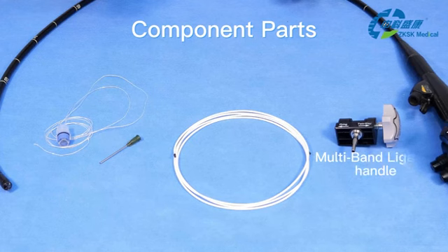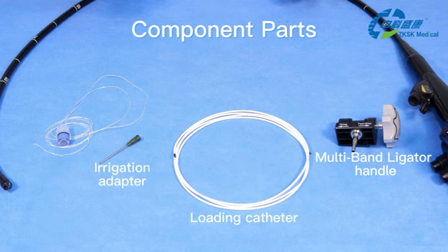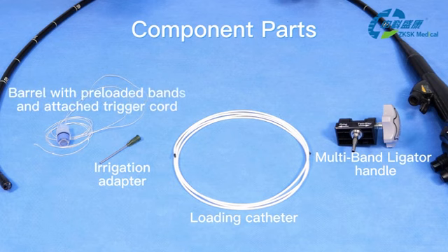Components include the multiband ligator handle, loading catheter, irrigation adapter, and barrel with preloaded bands and attached trigger cord.